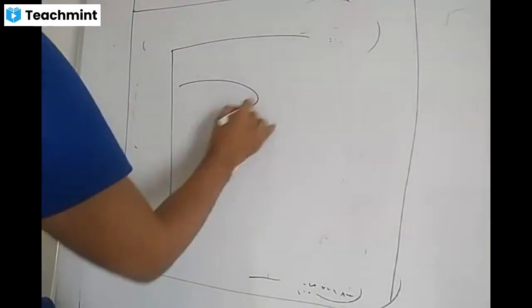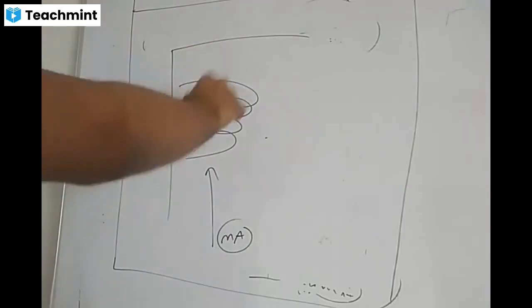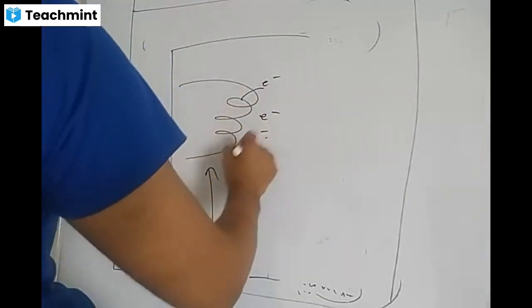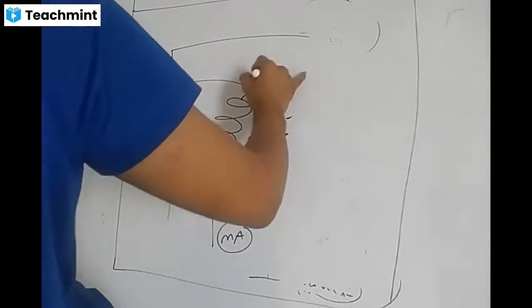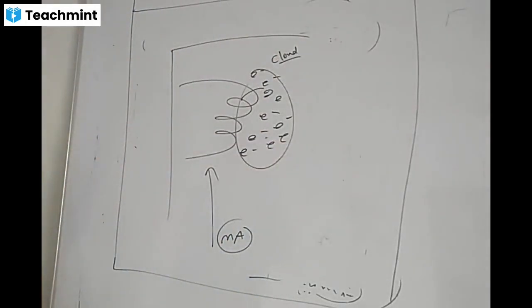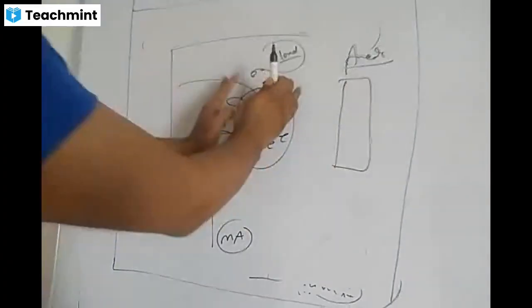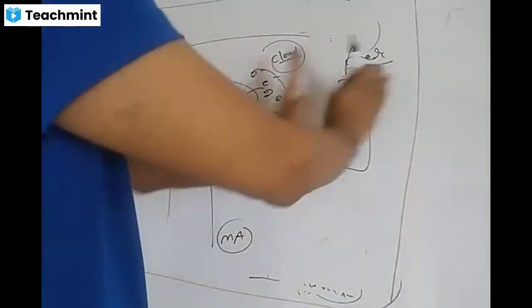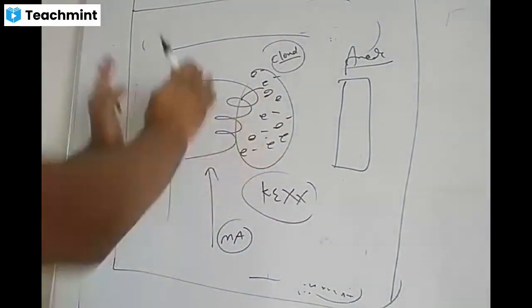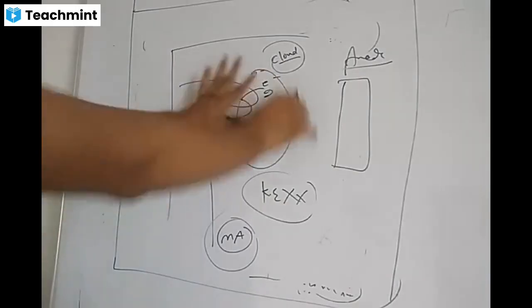This is your cathode filament, and what we applied is milliampere. So current is applied, this current will heat the filament, and what comes out? Electrons. These electrons will form a cloud at the filament itself. At this point of time, these electrons do not have sufficient energy to move towards the anode. They do not have that kinetic energy to move towards the anode. We just gave milliampere, hit the filament, and what comes out? Electron cloud.